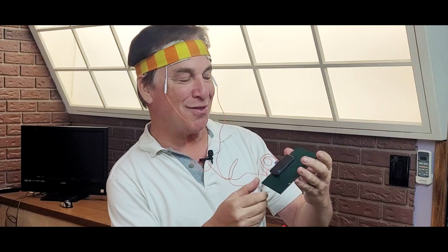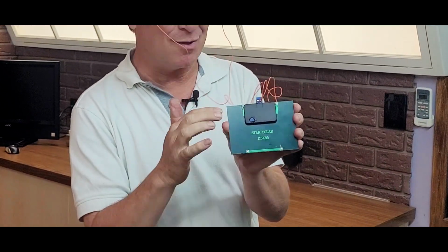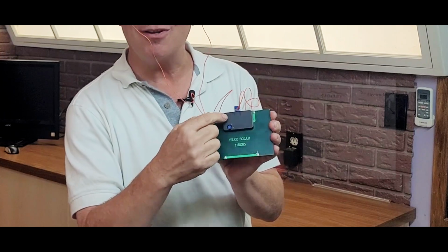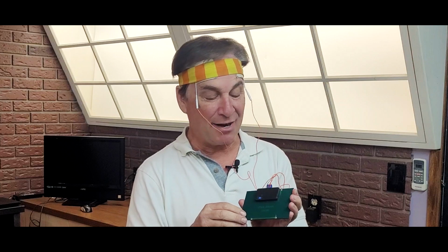So the circuit that we had for the previous tDCS videos works spectacularly well for this, but even that becomes incredibly simplified. So I'll show you the back here. Inside of this little plastic box that I just glued to the back of the solar panel, I've got our little current limiting circuit from the previous videos. I'm going to show you how to build it with a solar cell, and it's only going to require 3 components and a couple of very quick, simple electrical connections.